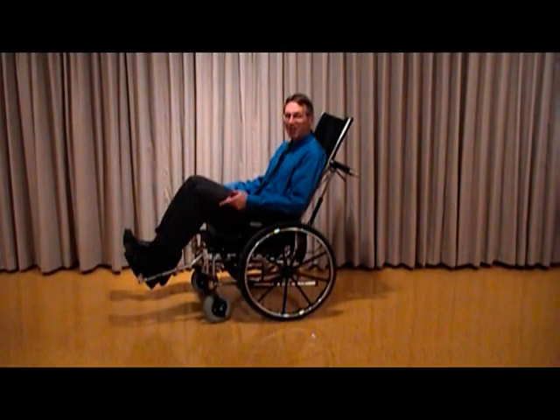Okay, this may look ridiculous to you, but I quite often see patients and residents who are adjusted this way, and it's very uncomfortable because the forces aren't being spread along the thigh like they should be. I'm taking way too much pressure on my bottom. So you want to make sure the leg rests are adjusted correctly.